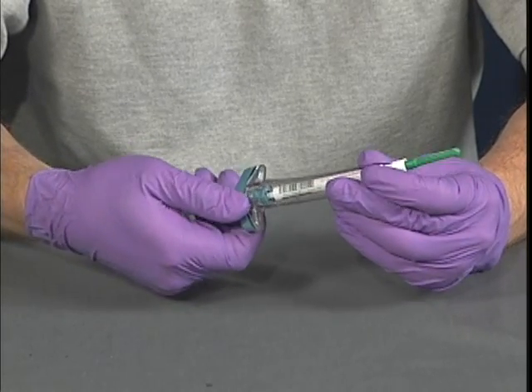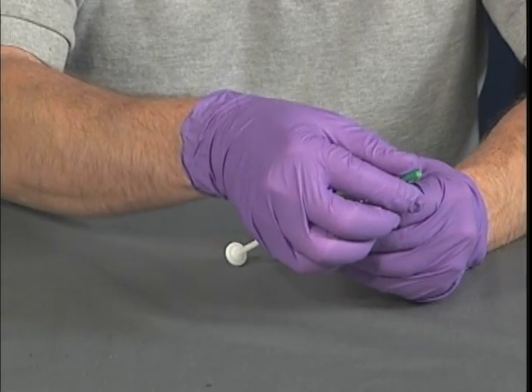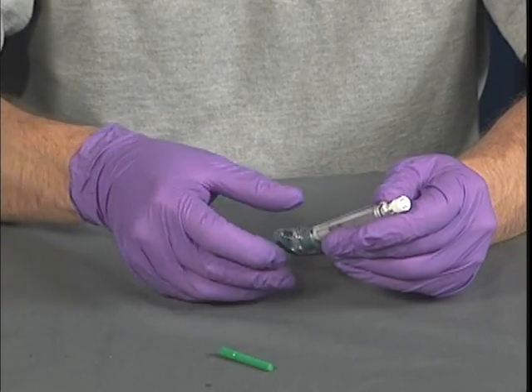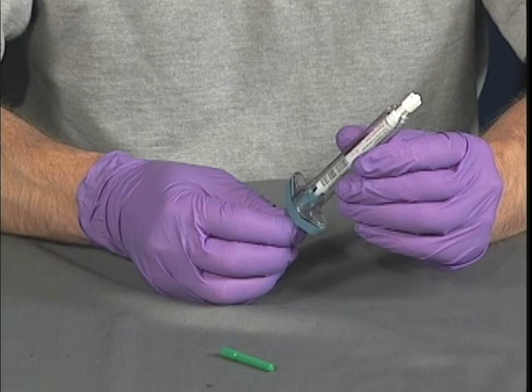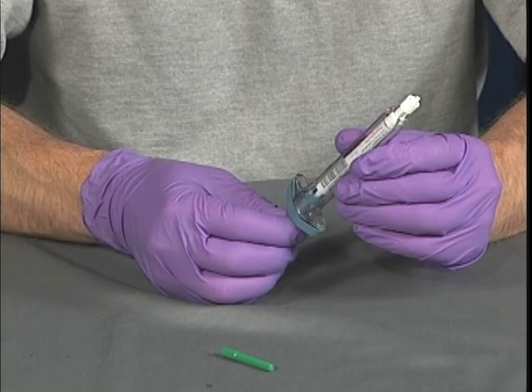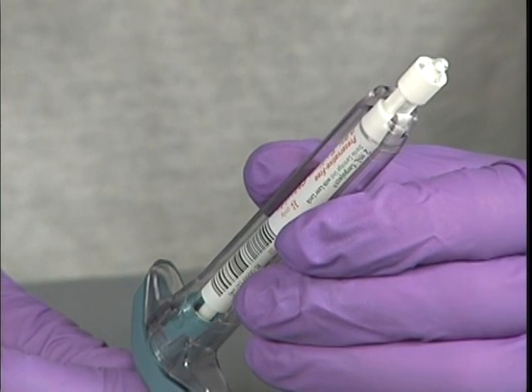With the unit now fully assembled, remove the protector from the distal tip and gently depress the plunger of the syringe until all the air is expelled and only the desired amount of medication remains in the syringe. The medication is now ready to be delivered.